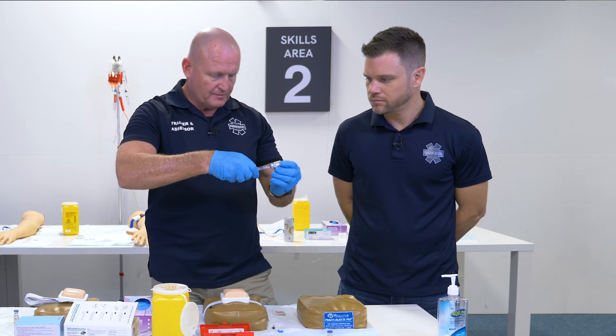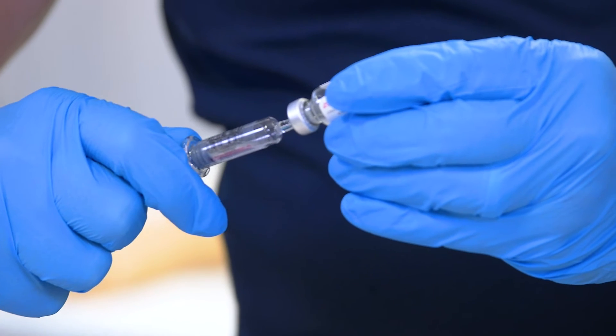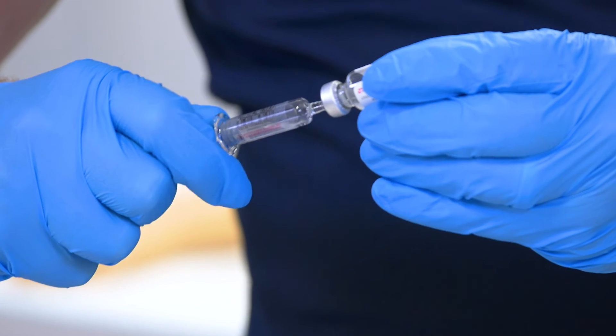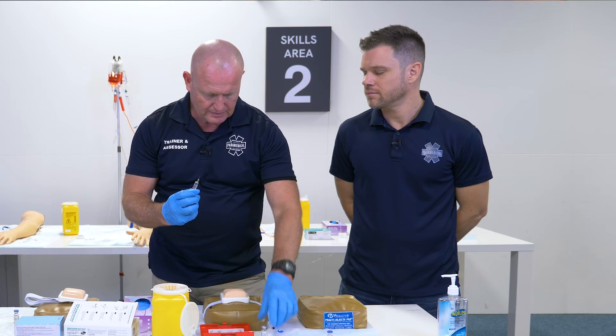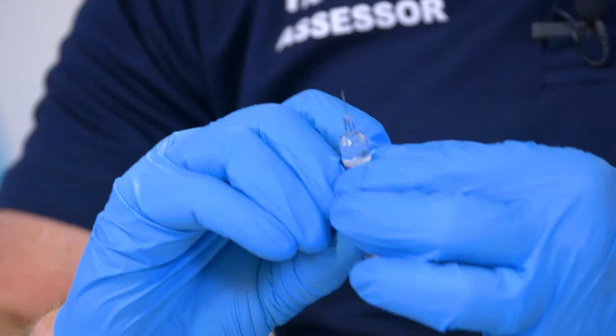This is the hard part — try and actually draw all of this up. Make sure you draw it all up. Make sure you've got rid of all the air bubbles — air bubbles away.